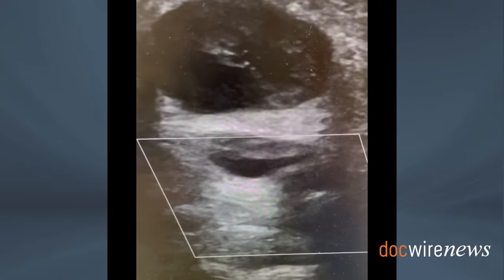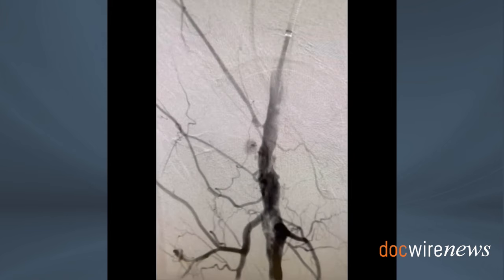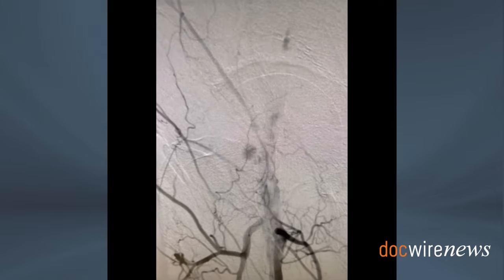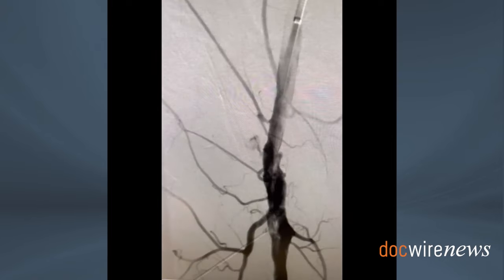We initially elected to inflate a balloon in the area where the pseudoaneurysm is originating, thinking that this would by itself lead to extension of the thrombus. As you see here, there is still a residual extravasation into a small pseudoaneurysm cavity. The prolonged balloon angioplasty for 5 minutes did not lead to closure of this small cavity, so we had to inject it.